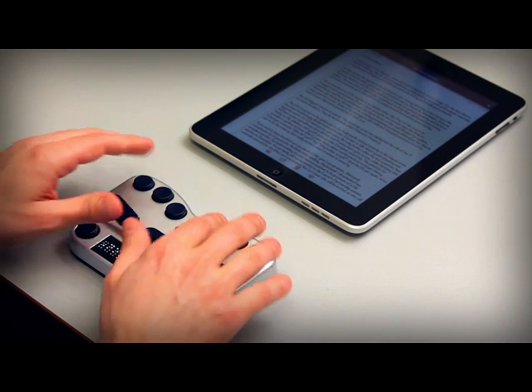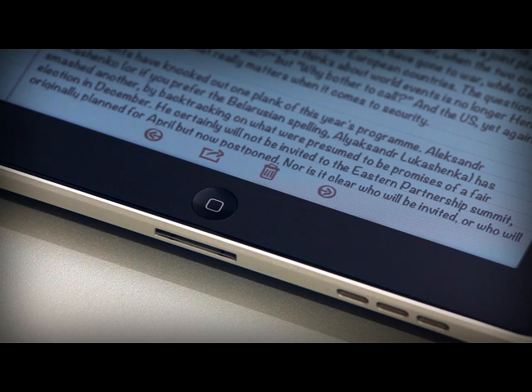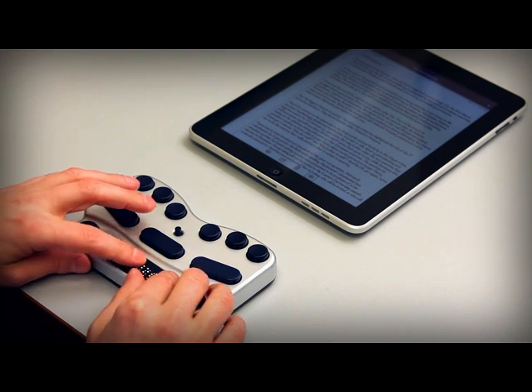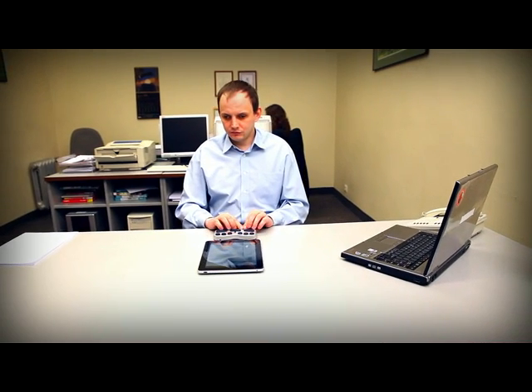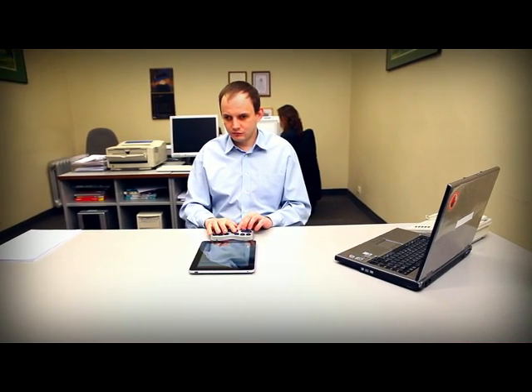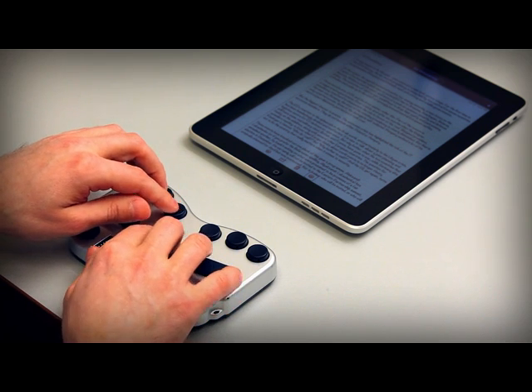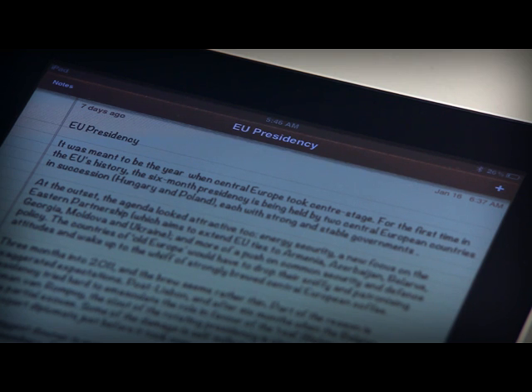To move from the top of the screen to the bottom, press space plus dots 456. In Notes, this moves you right over the note text to the last of a set of controls at the bottom of the screen. To move from the bottom of the screen to the top, press space plus dots 123. In Notes, this moves you all the way to the Notes button where you started.